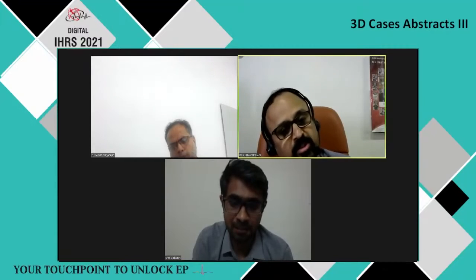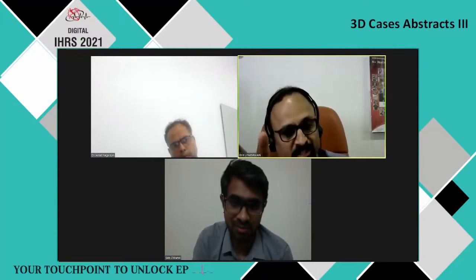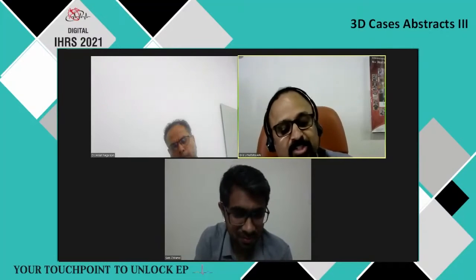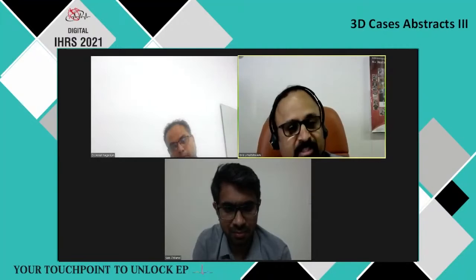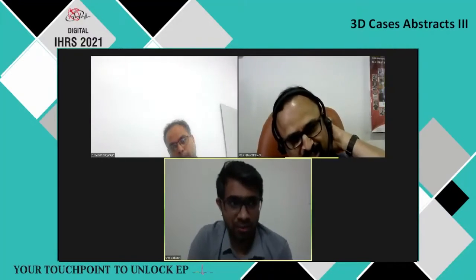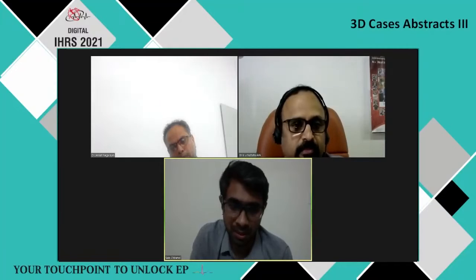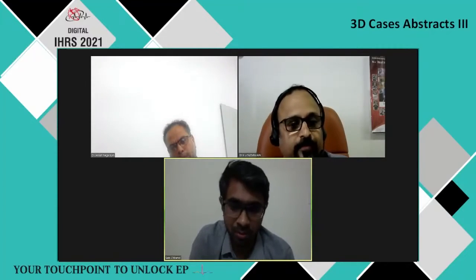And your mapping was point by point mapping, or you used some multi-electrode catheters? We use point by point, sir. Okay. What is the equivalent of the HD Grid of Abbott? What is the multi-point mapping that you have with your system? Is there any multi-point mapping system available? As of now, we don't use a multi-point system in our hospital, sir. But we do sometimes get Pentarray, but that's not the usual one that we normally use. We normally use point by point SmartTouch.